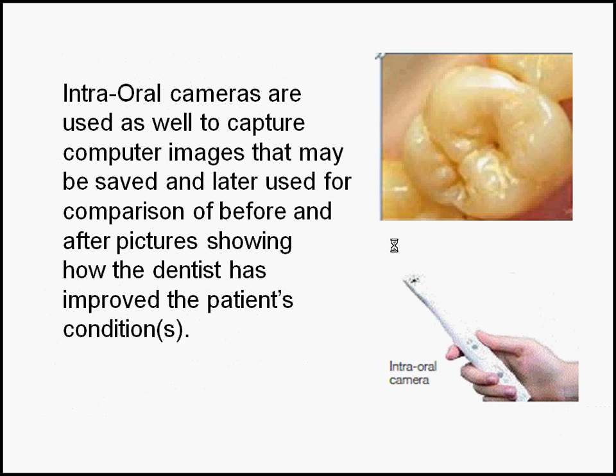Intraoral cameras are used as well to capture computer images that may be saved and later used for comparison, or for before and after pictures showing how the dentist has improved the patient's conditions.